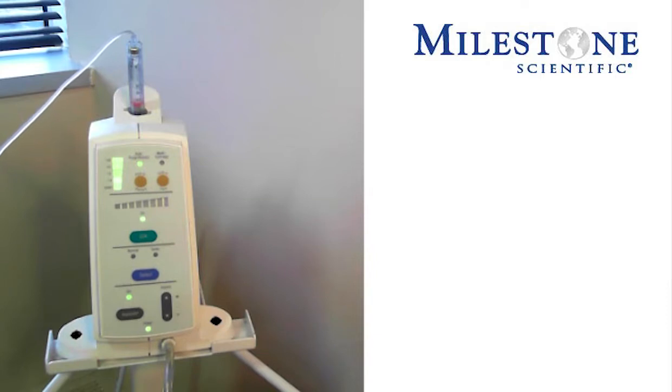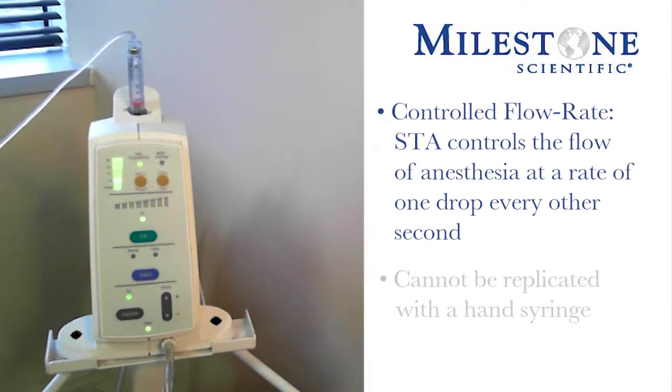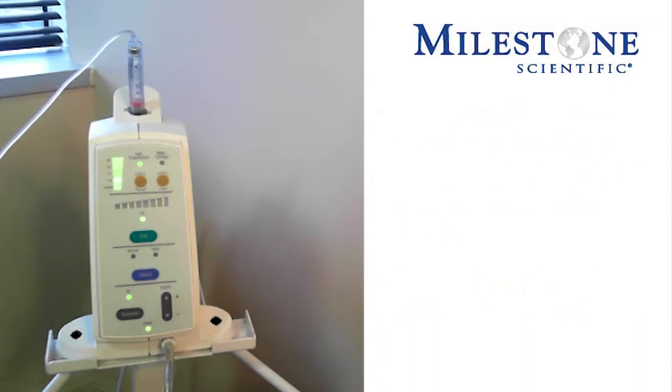In these two sections, we have our different flow rates of anesthesia depending upon the injection technique we're doing. The STA is also referred to as the controlled flow rate, meaning that the instrument controls that flow of anesthesia at a rate of one drop every other second. This flow rate cannot be replicated with the traditional hand syringe. With this controlled flow rate, you will do single tooth injections as well as anything on the palate.